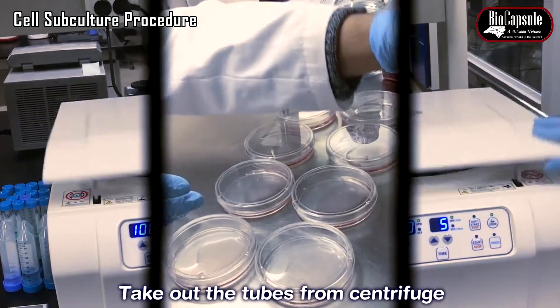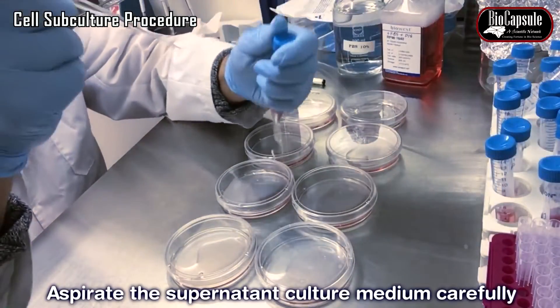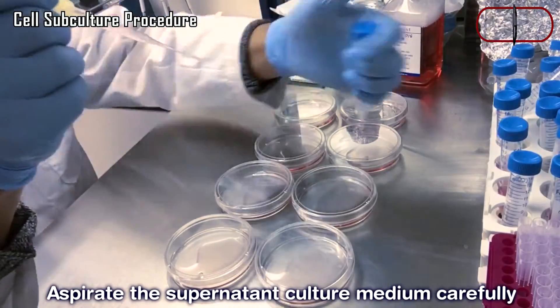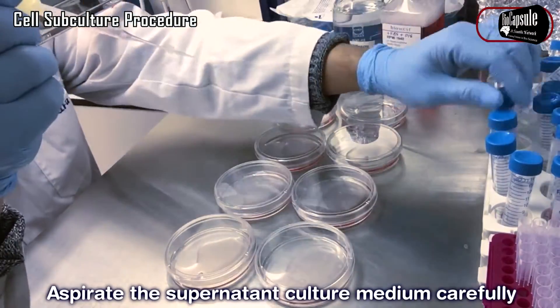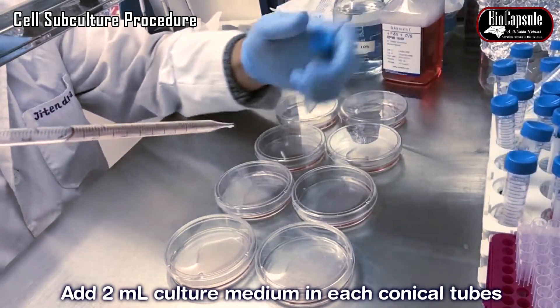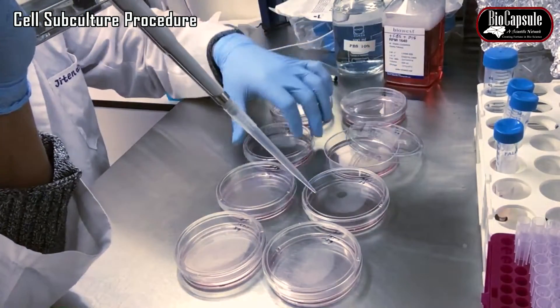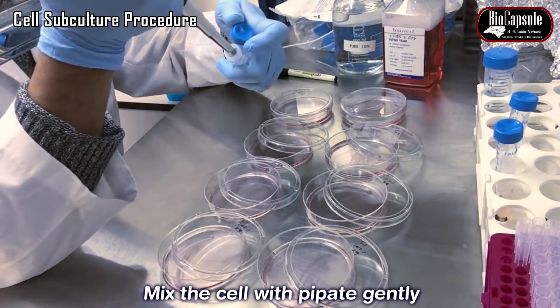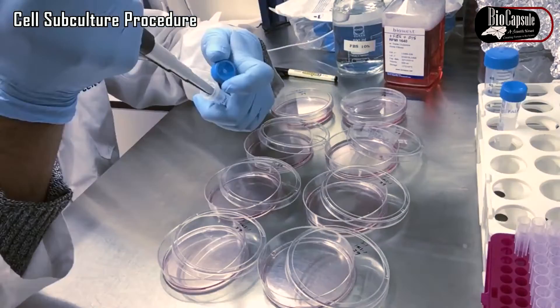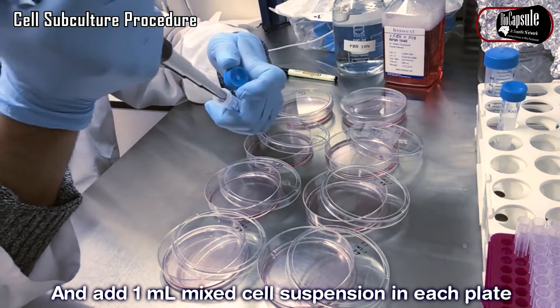After centrifugation, bring the cells and remove all the supernatant with the aspirator. Add 2 ml of complete fresh medium to the cells. Mix the cells with a pipette, then add 1 ml of cell suspension into each new culture plate.